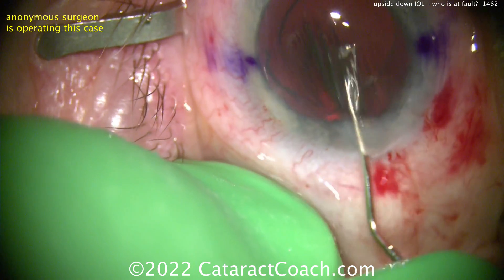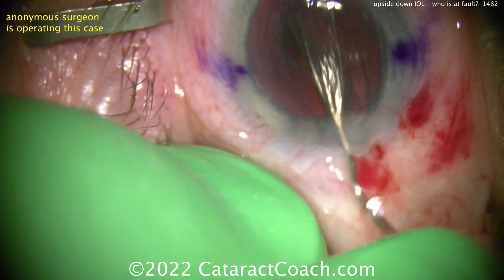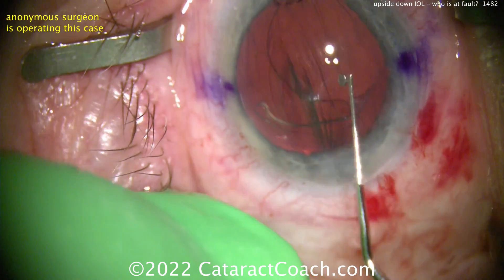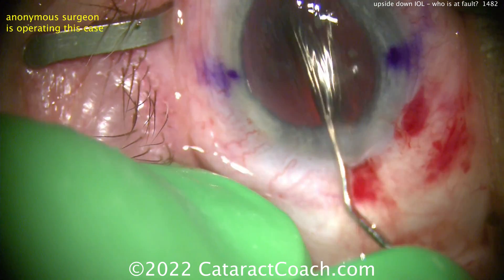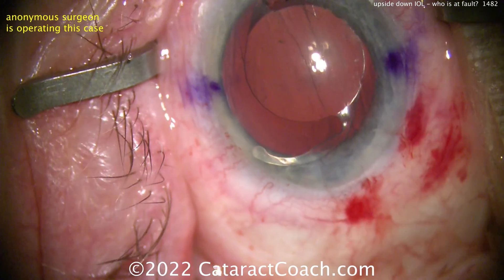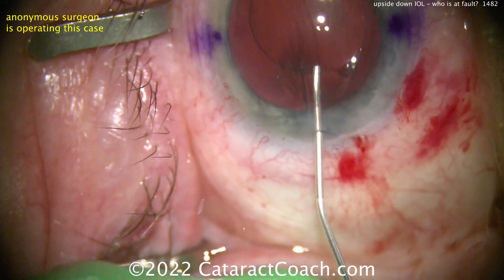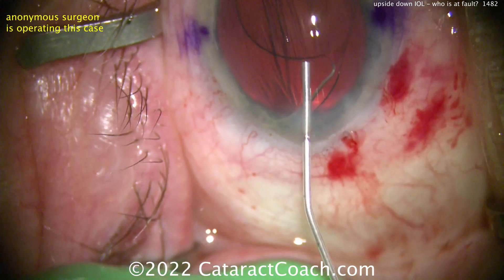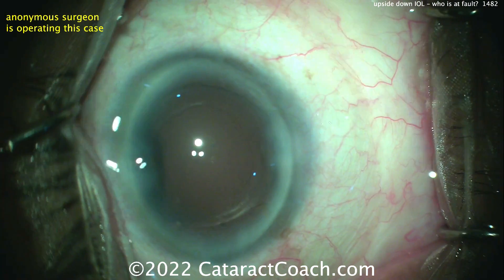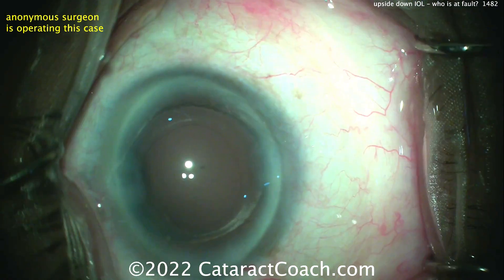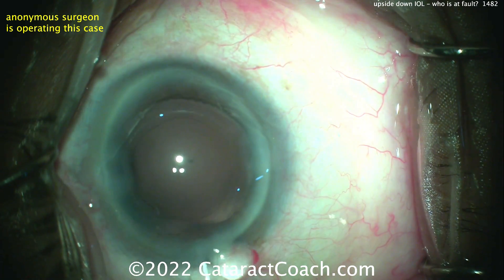The surgeon is struggling a little bit. I'm hopeful he or she is able to get it into the correct orientation. I only have this portion of the video — the surgeon wanted input and this was an anonymous submission; not sure which country. Here's the second case, another anonymous submission: empty capsular bag filled with viscoelastic, here comes the lens going inside the eye.